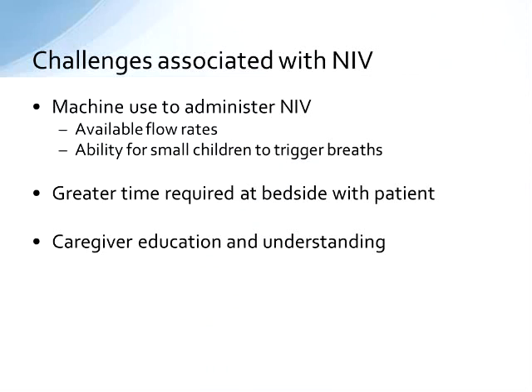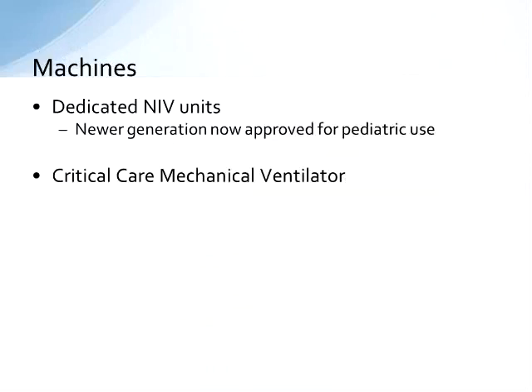So I'm sure I'm not telling you anything you don't know. Those patients do tend to be a bit more time-consuming. And caregiver education and understanding is a huge hurdle that we have to jump. Everybody needs to understand what we're doing. Everybody needs to understand the importance of an interface that fits appropriately and not cinching it down on their face super, super tight. That includes mom, dad, grandma, grandpa, any caregiver in the room, bedside nurses, physicians, residents, and of course the respiratory therapist. So the entire care team really needs to be involved in the education portion and desensitization of the device.